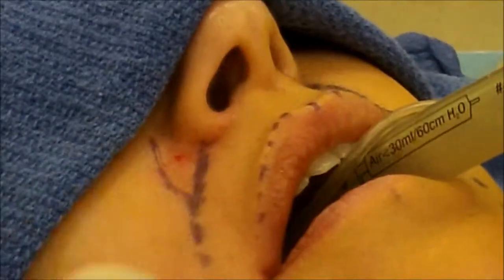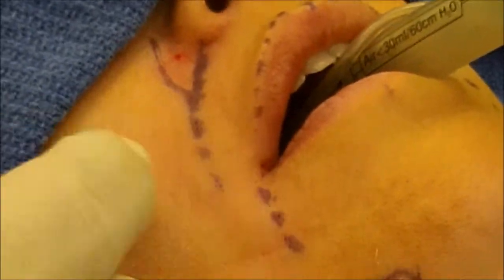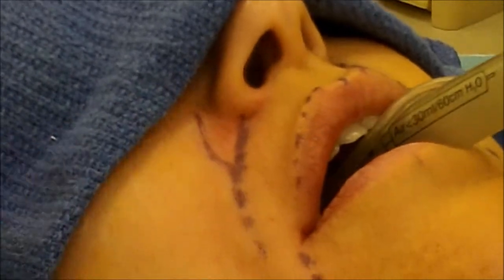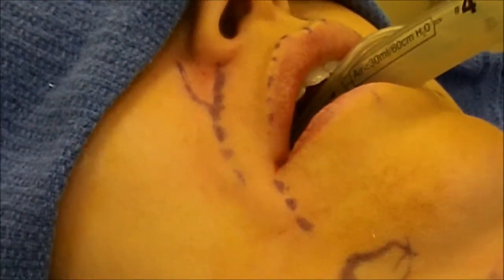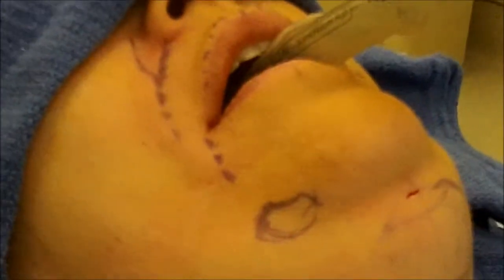A little bit more fullness into the lip like a liner, done the oral commissure and turned up the corner of the mouth. Also done the entire piriform area — what we call the nasolabial folds or the smile lines, the parentheses — and that's filled as well. Now we're going to do one more syringe on the other side. That was one full syringe on this side; we're going to do another full syringe on the other side.